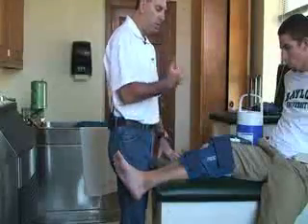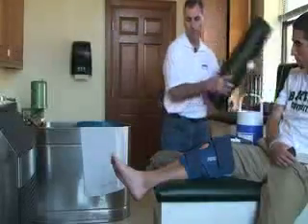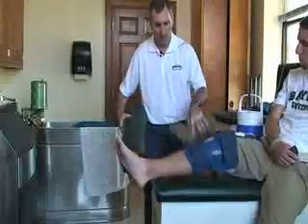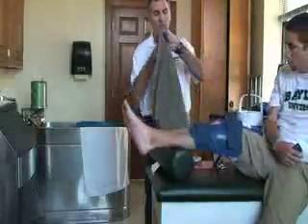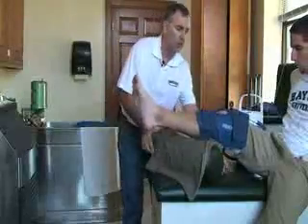Once the attachment is secure, you can elevate the body part. Also, for safety, make sure you have a towel underneath just in case it does leak.